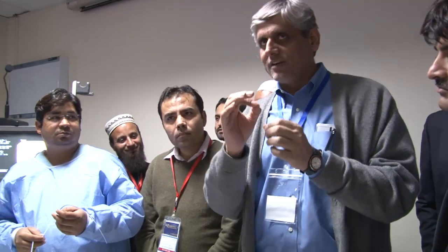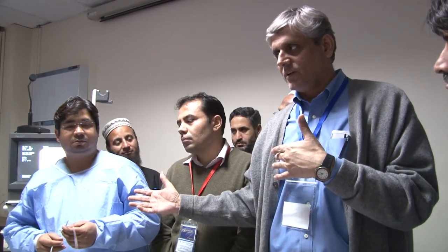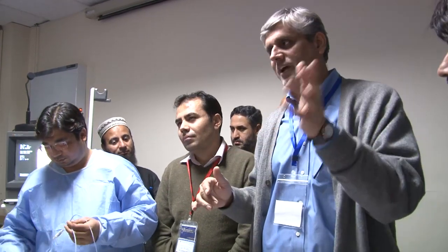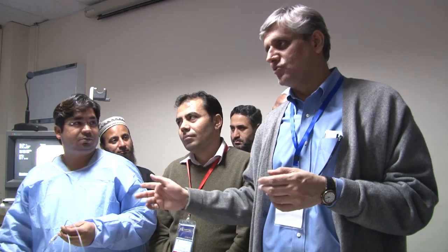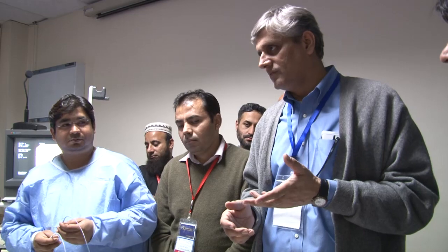it's not going. It's not going because you're not using a simple technique of pull back and advance. Pull and advance, pull and advance. These go together. You can make up any language of your own with the technician. I don't have to have a language with Wasim. We understand each other now. Telepathy. He knows what I'm going to do. I know what he's supposed to do. I know he'll do that. So quite often we don't even have to talk. Release is all I tell him.